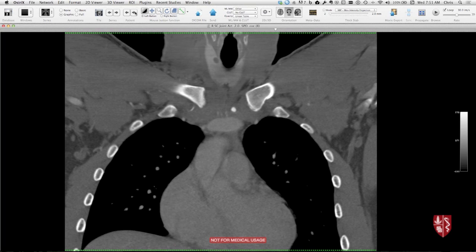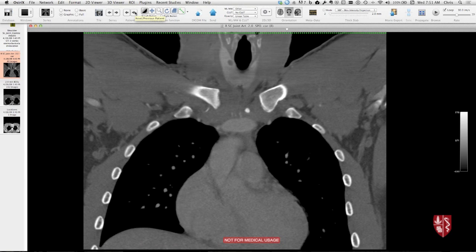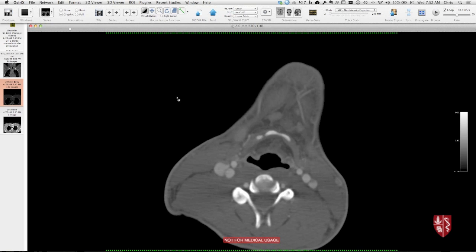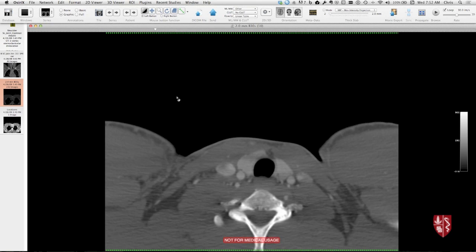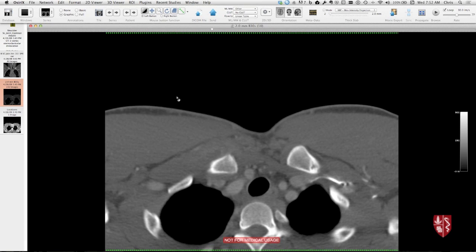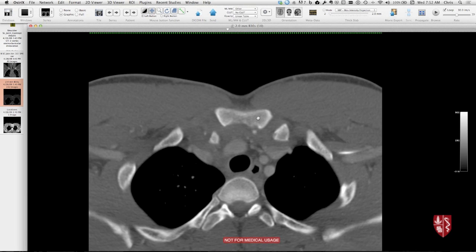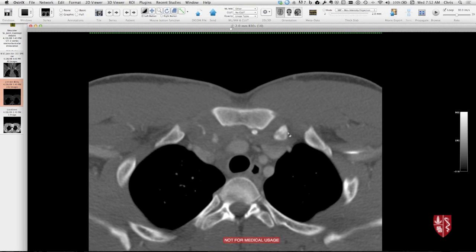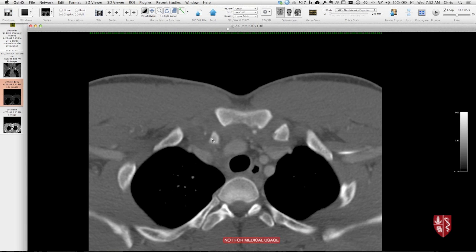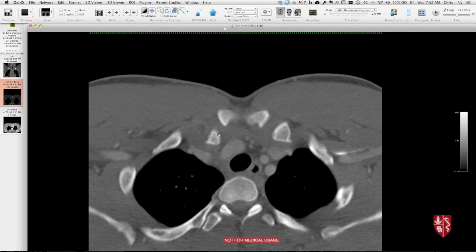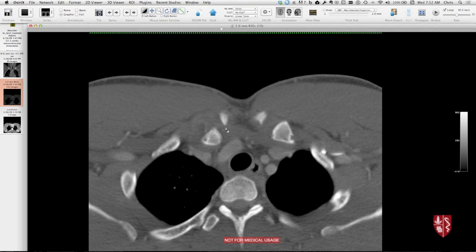This one is a unusual case. We know that the mid and distal clavicle are easy to assess radiographically, but the sternoclavicular joints are very difficult to see on plain film. So if there's a suspicion of a sternoclavicular joint injury, CT is a good way to go. This was a contrast-enhanced CT from a patient with suspicion of sternoclavicular joint injury. You just have to be very careful as you're going through to look at the alignment. So as we go down here — here's the manubrium, top of the sternum, here's the left clavicular head here. You can see that the alignment there is pretty good, but look then on the right side — the clavicle is displaced posteriorly here. It can be subtle, so you have to be carefully paying attention to that alignment. You see the anterior piece of clavicle here compared to the manubrium — it's posteriorly displaced.